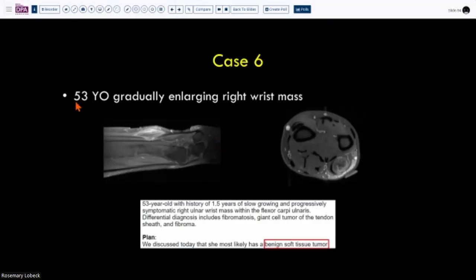So here we have a 53-year-old patient who had a gradually enlarging right wrist mass. So you can see the mass both in the axial and the coronal here. So there's a small little mass over here just underneath the skin, looks really nondescript. So the surgeon sees it and says, oh, it's fibromatosis, giant cell tumor, fibroma, whatever, it's benign. So I'm going to take it out, right?